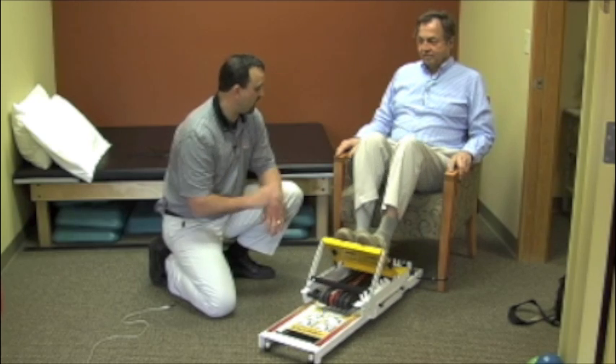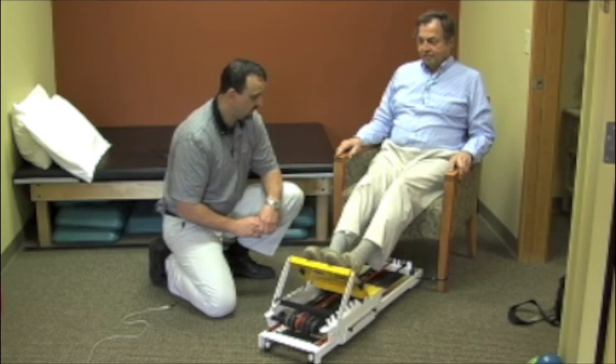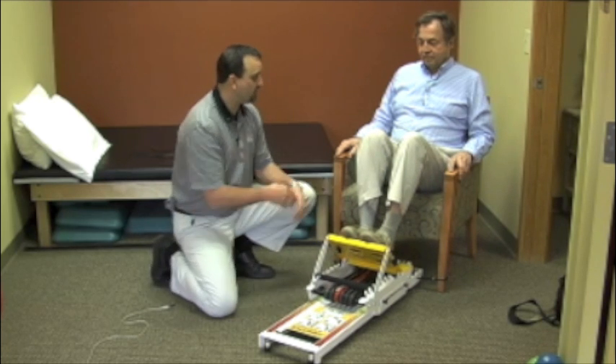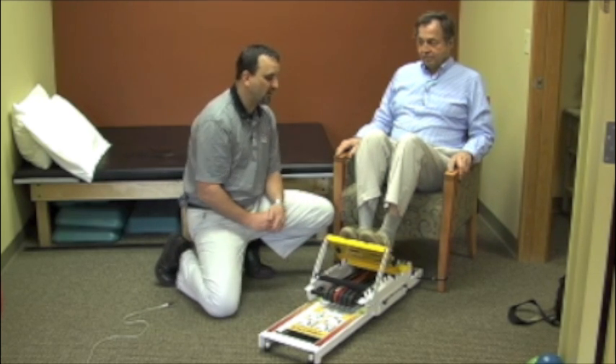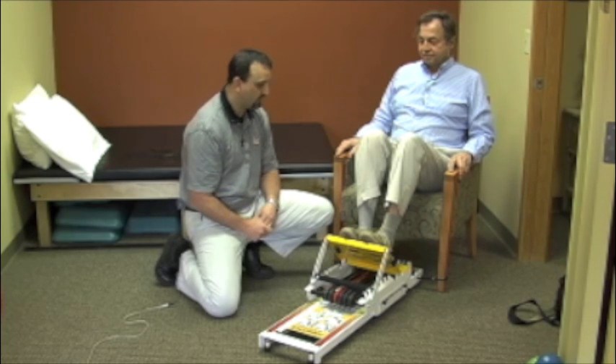The first thing that most people who get on the Mini Press will notice is how smooth the glide is — it's really almost effortless how it slides up and down the rail. From this type of position we'd be working on things like sit to stand, leg strength, and leg control.